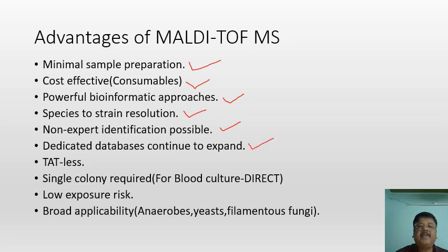Then dedicated databases continue to expand. So this is now in the beginning phase. Over a period of time, databases will get enriched, so again, it will improve the quality. Turnaround time is very less. So again, it is beneficial for the patient, especially for management of critically ill patients, and for prevention of antimicrobial drug resistance.